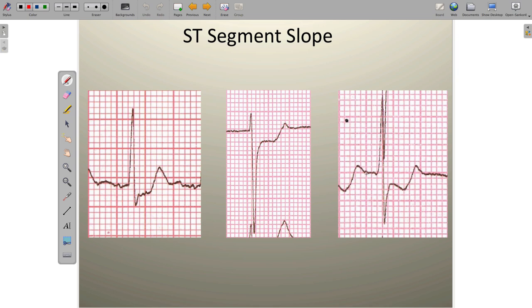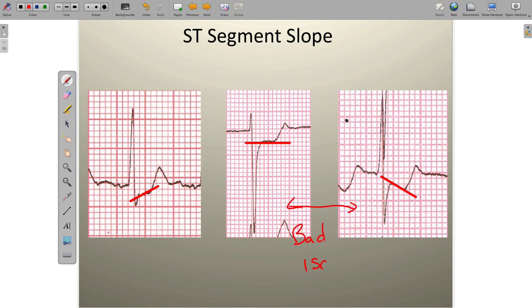Next, we want to look at the ST segment itself and the direction or slope in which it's traveling. There are three possibilities: an upward or up-sloping ST segment, a horizontal ST segment, or a down-sloping ST segment. Horizontal and down-sloping ST segments are always bad — think myocardial ischemia. Up-sloping ST segments can sometimes be okay, but they have to be rapidly rising — almost a vertical approach. You'll sometimes see this in stress testing with a healthy heart, where the ST segment dips a little below isoelectric due to exercise-related supply and demand imbalance.